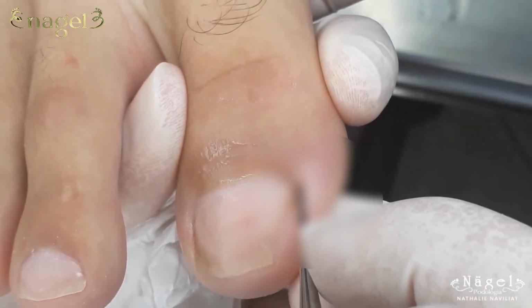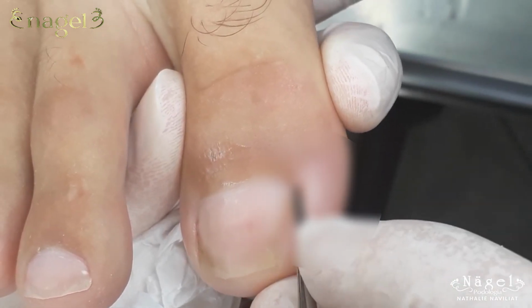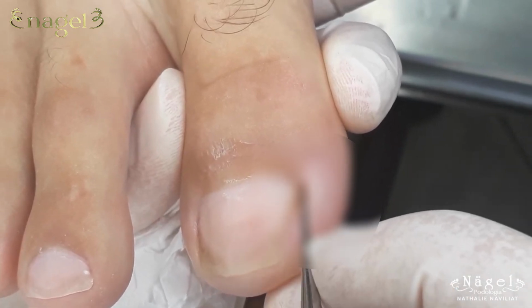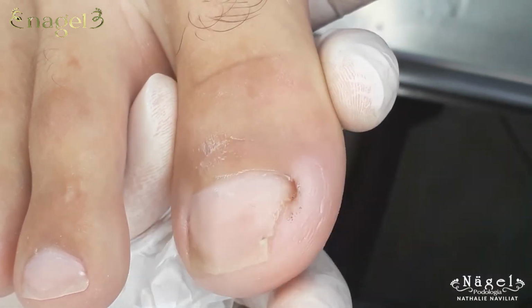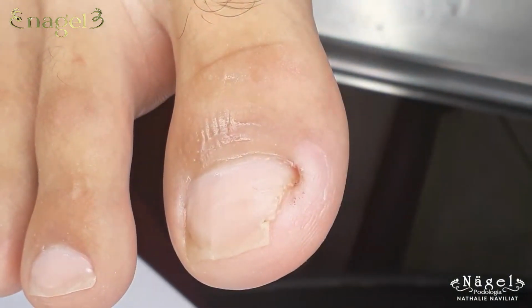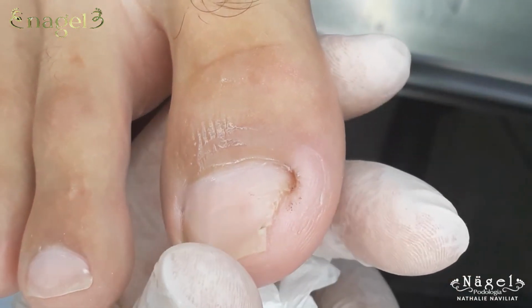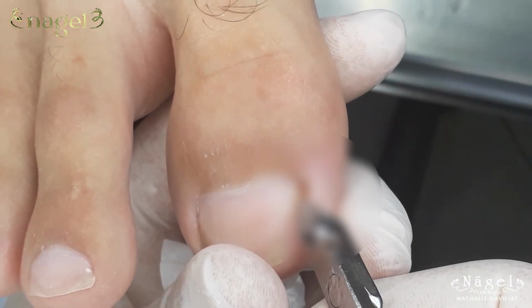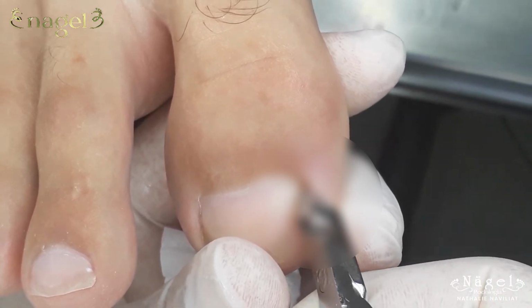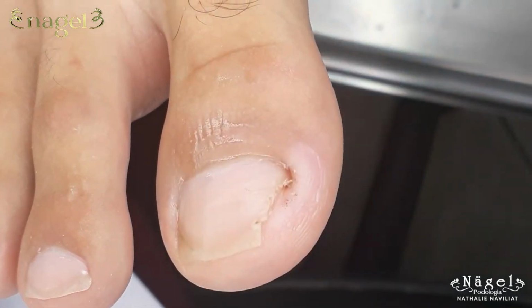Today I'm working with a super special patient and I'm excited to share with you a really important procedure for foot health. We're tackling the removal of ingrown toenail spurs on both of his feet, starting with the right foot on the big toe, outer side, and then moving to the left foot also on the big toe, outer side. I'll walk you through every step in detail so you can understand exactly what I'm doing and why it's so crucial. Ready? Let's dive in.